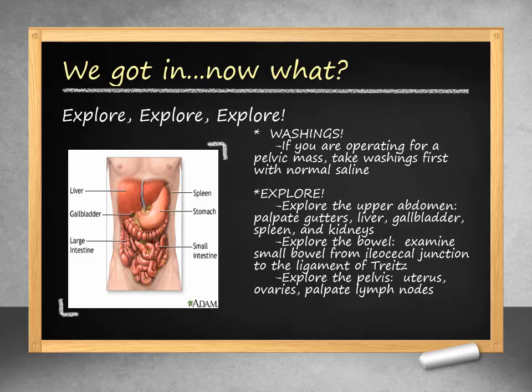We now have an adequate incision. In the case of a pelvic mass or any concerns for malignancy, pelvic washings with normal saline should be obtained. Next is the most important step that should not be forgotten: exploration. This should be done in a systematic fashion with exploration first of the upper abdomen, followed by running of the bowel, and finally exploration of the pelvis.